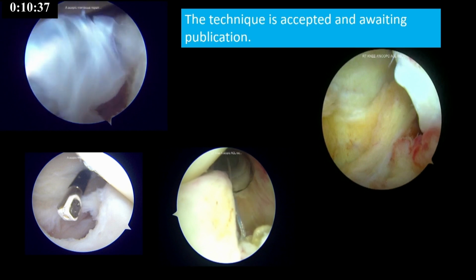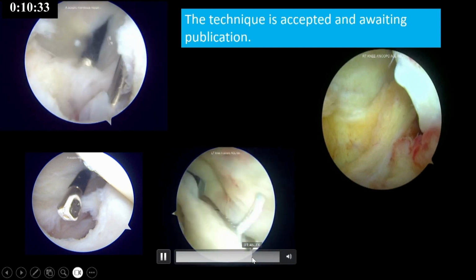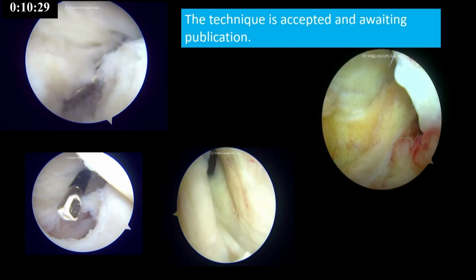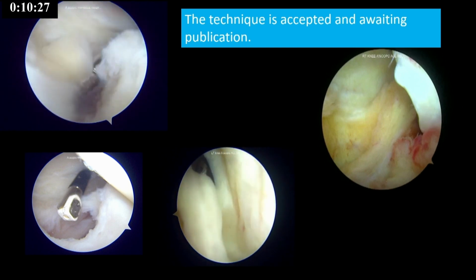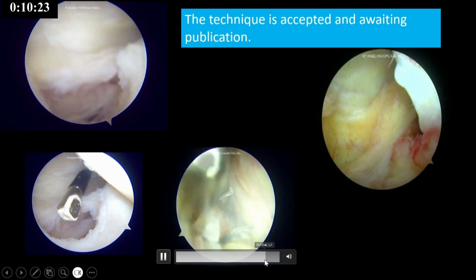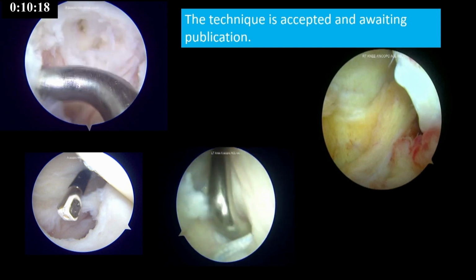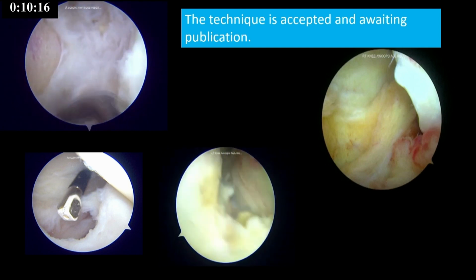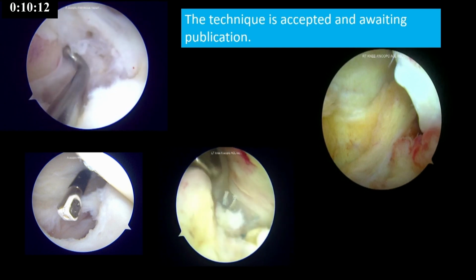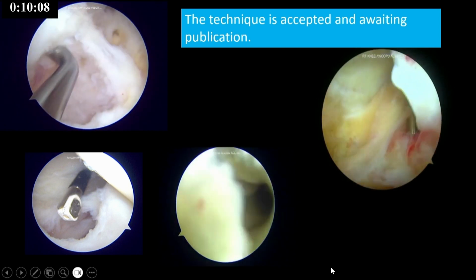So you can have either one suture or two sutures going there, and these are what we call meniscotibial and meniscocapsular separations. So those are two sutures which are being taken, and in interest of time, I'll just cut this short to show you how the ramp is reformed now. This is attached to the posterior tibia, and this will get synovialized to give rise to a proper ramp repair. We have done as yet about 20 cases. We are in process of presenting them as a review case as well.